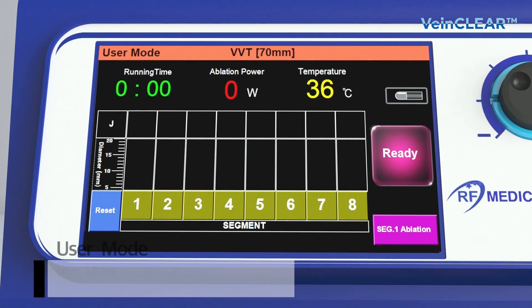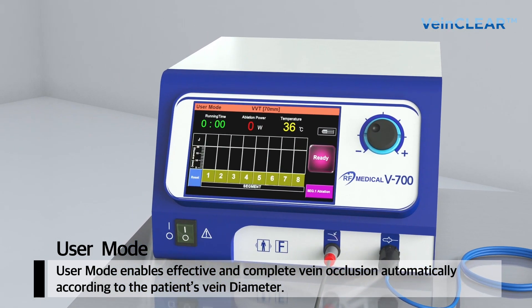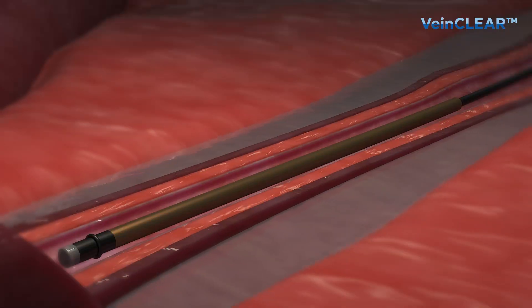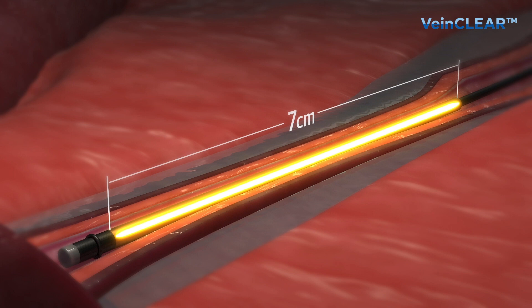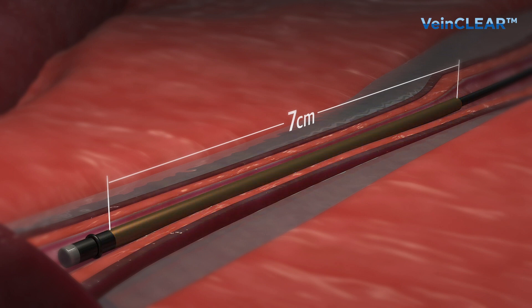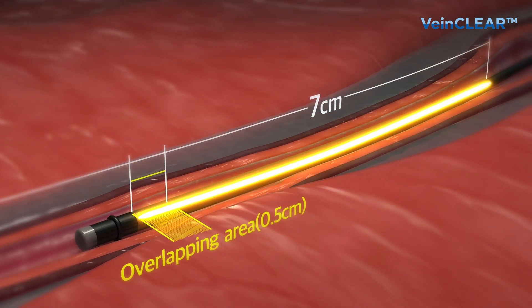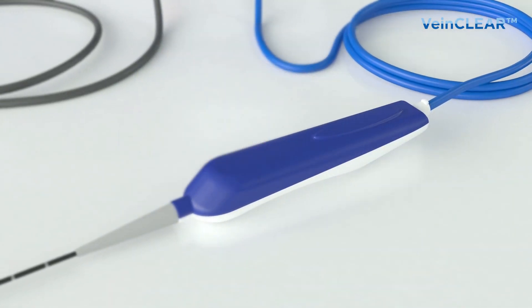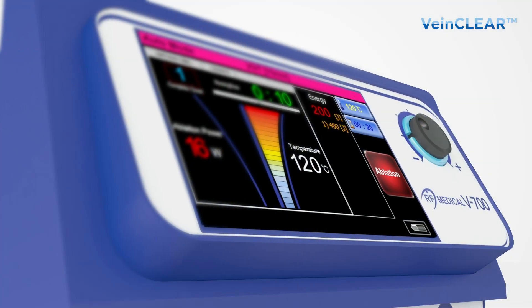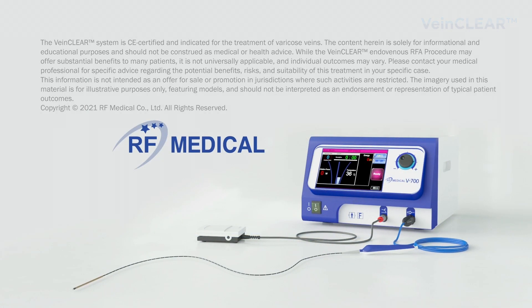The user mode enables effective and complete vein occlusion automatically according to the vein diameter. When the treatment is performed with a 7 centimeter heating element, 0.5 centimeter overlapping ablation between the ablation segments will be made due to the 6.5 centimeter length of the marking intervals.